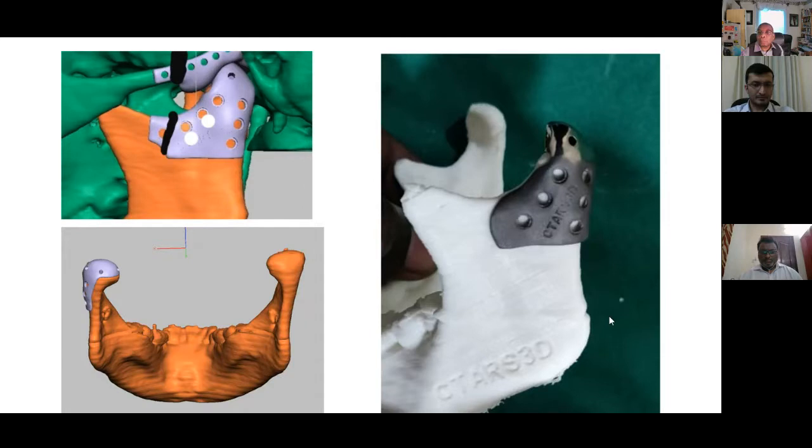The main rationale for this kind of minimization of the process is that a subcondylar fracture or a low condylar neck fracture could very well be plated with a lambdoid configuration of plates, which we use for fixation in trauma. Why can't that same lambdoid pattern be incorporated into the lateral flange and make it a smaller one? And we need to replace only that condylar cap.